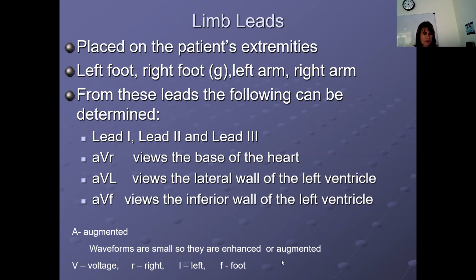This is right arm, this is left arm, and then this is the left foot. It's easier if you guys just add it to your notes. So AVR is the lead that's on the right arm, and it's viewing the base of the heart. Remember, the base of the heart is the top of the heart. It's where your major vessels come out. So that's the base of the heart.